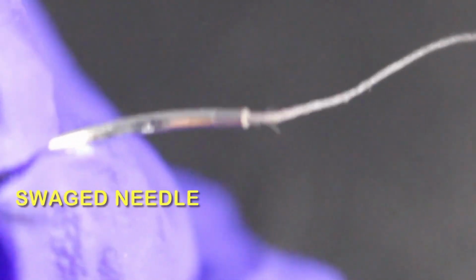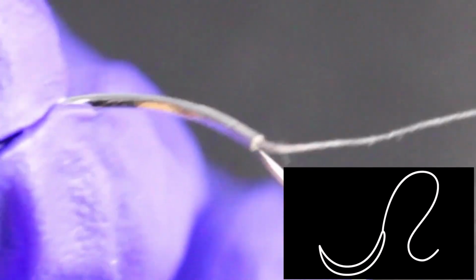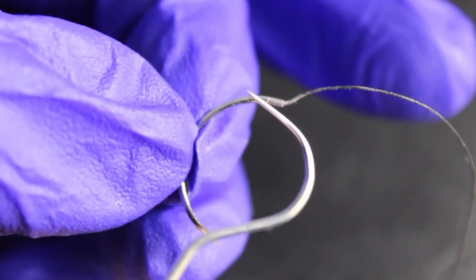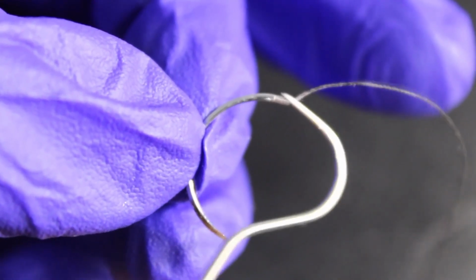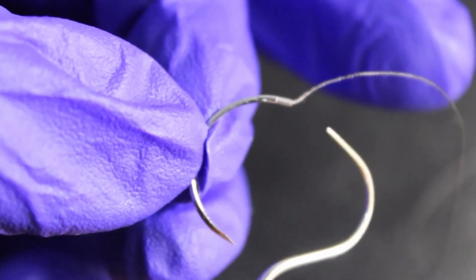The swaged needle is really interesting because the suture and the needle are joined as a single unit. And this is actually very important because it reduces the tissue trauma. So you're not dragging a separate thread through the tissue, which can minimize the damage.